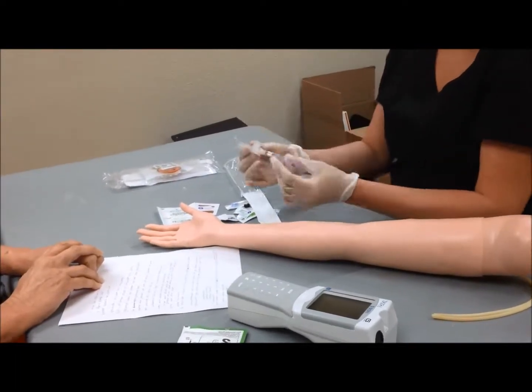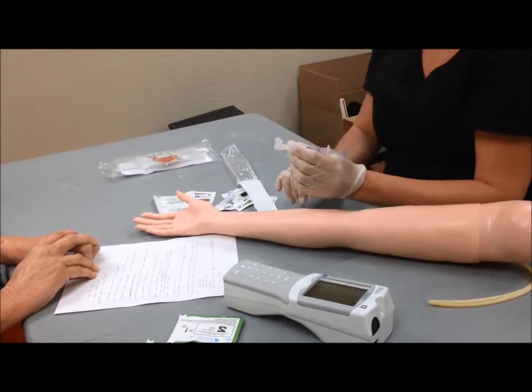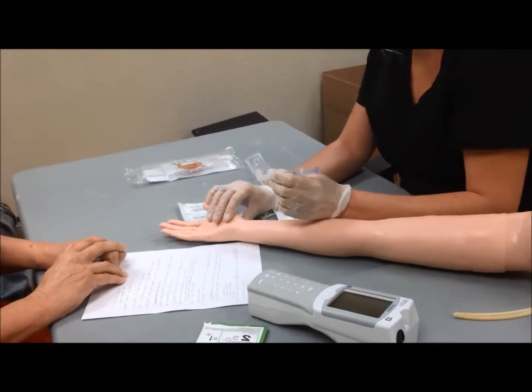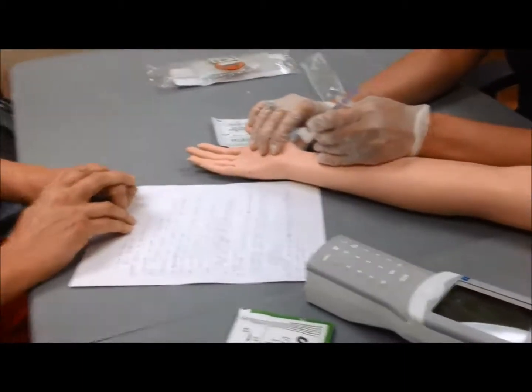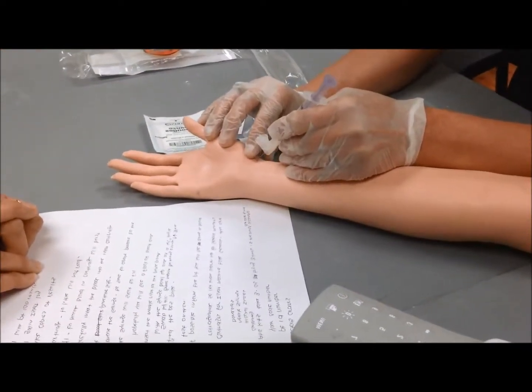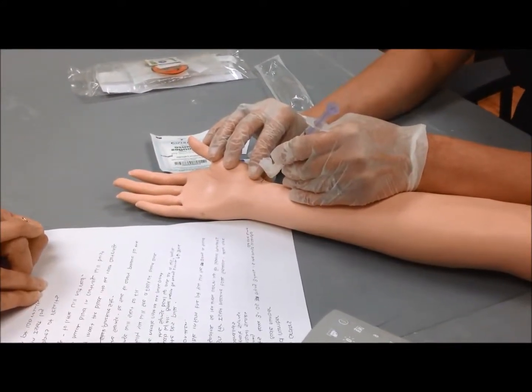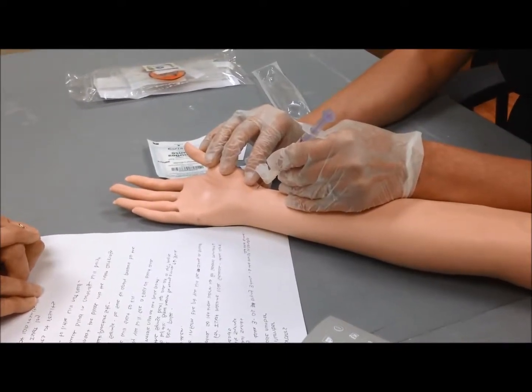Then you can take the cap off of the syringe, and at a 45-degree angle, approximately, bevel up, you will insert the needle right in front of the area that you found the pulse in. You will insert the needle and hopefully you will see a flash. That means you have hit the artery, and the syringe will start to fill.